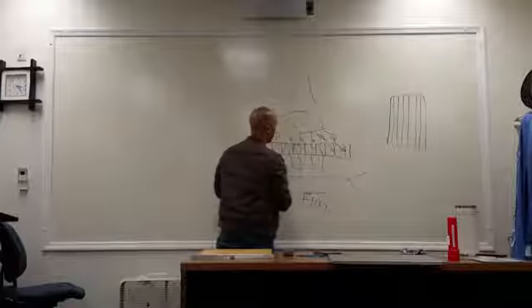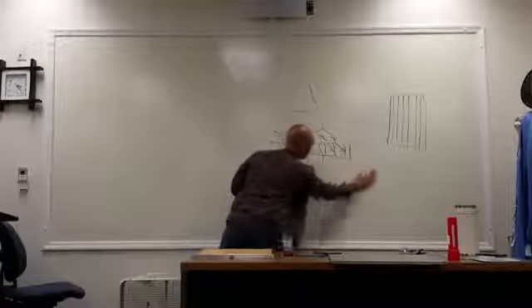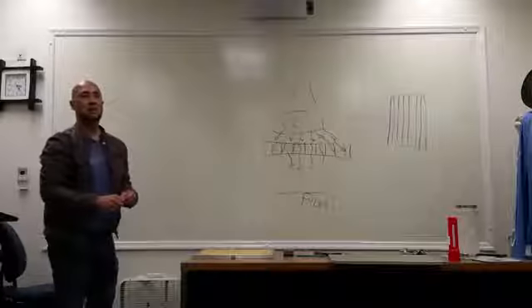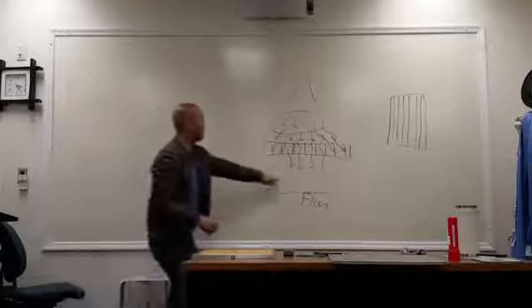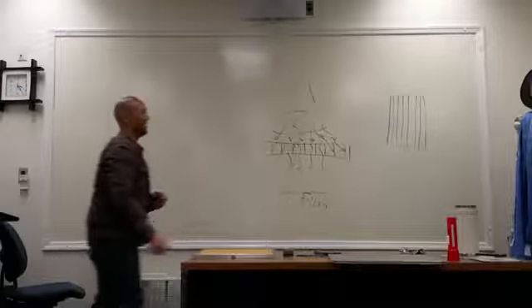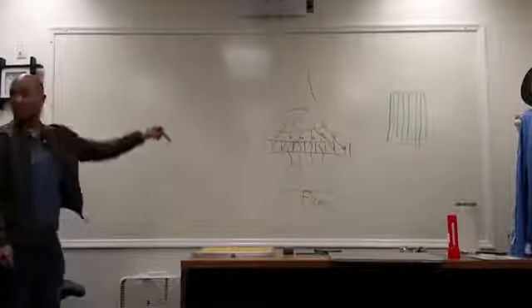So it just gives them like fine slots for the X-ray to go down, right? It's like a slot. Yes, so they're lead slots. That's so confusing. Didn't you say the patient was above it? Yeah, that's why I took him out. There's my patient right here. My film's down here. Yeah, so that's what's happening there.